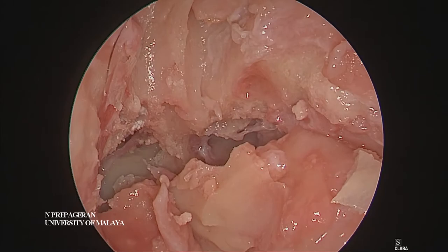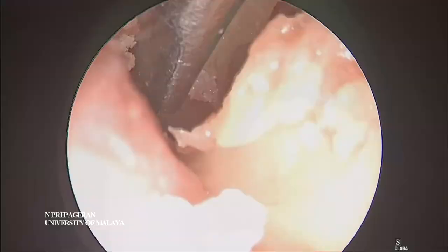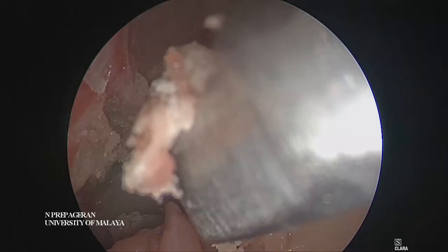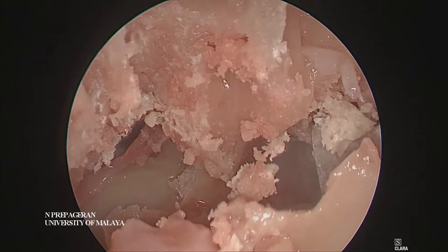Is that clear guys? That's the frontal beak we are removing. So if you remove this beak a little bit more on this side, and remove this beak on the other side, you'll get Lothrop done.